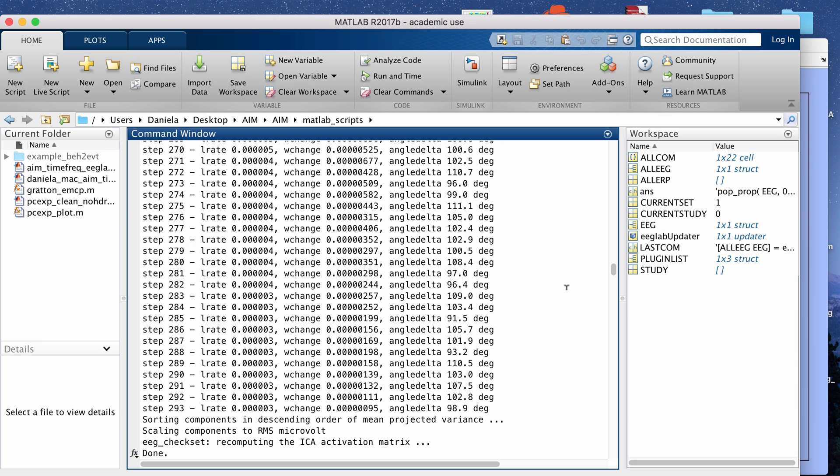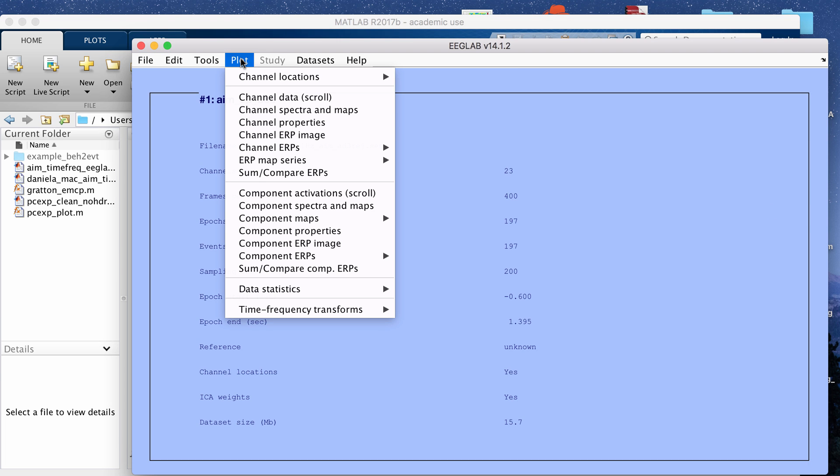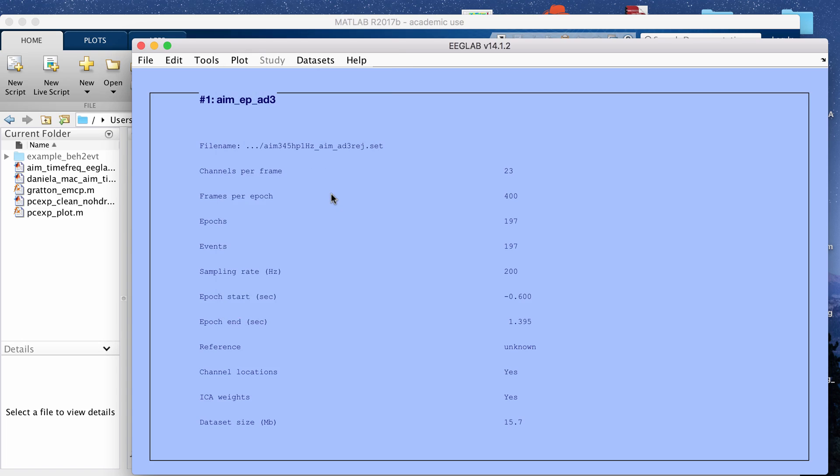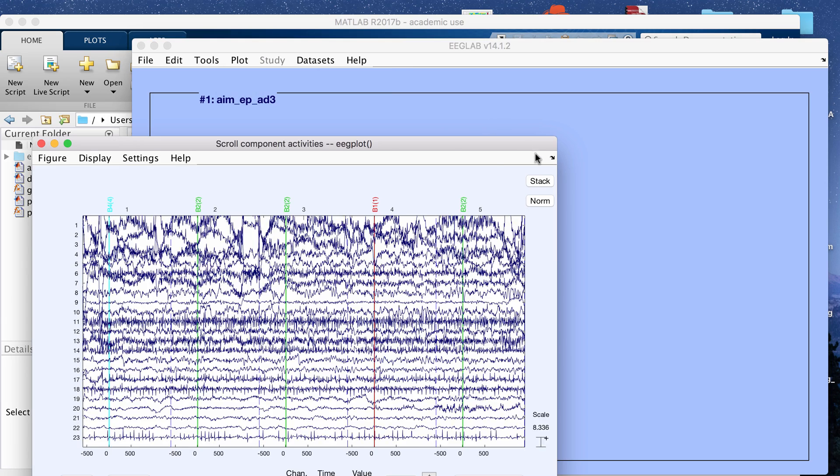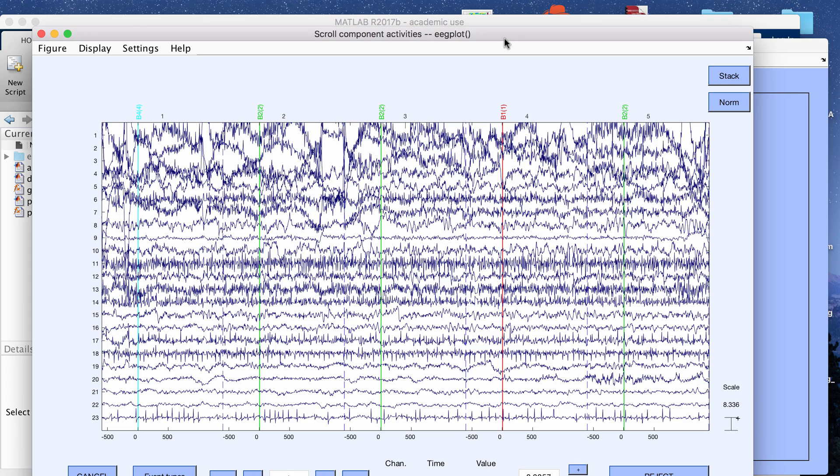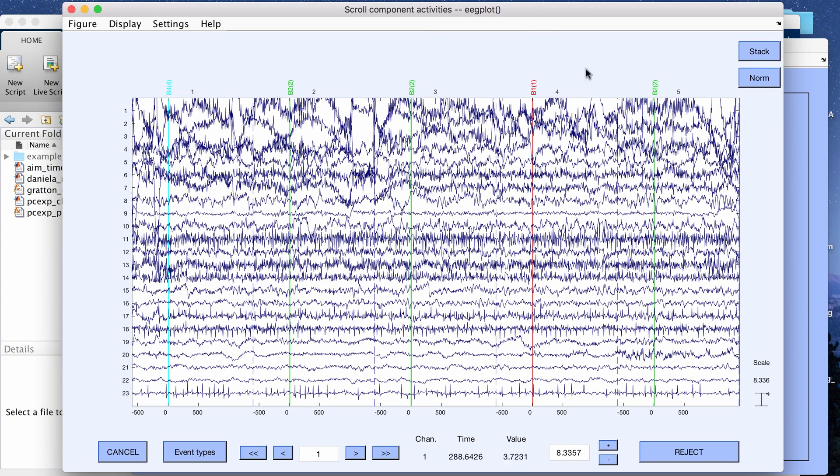For me that only took a couple of minutes to run and once that is done then you can go to plot component activation scroll to plot the actual EEG signal from each component. In this sample data that I'm using, I have recordings from 23 electrodes.